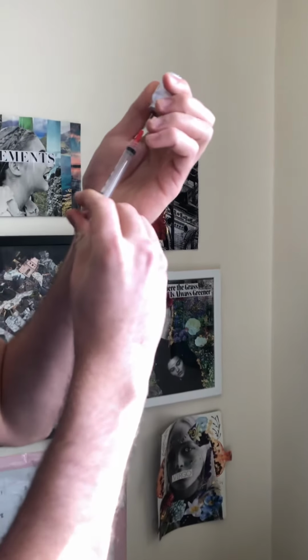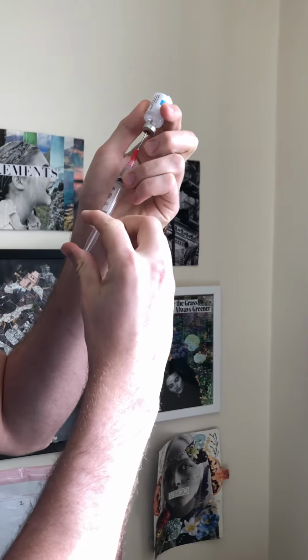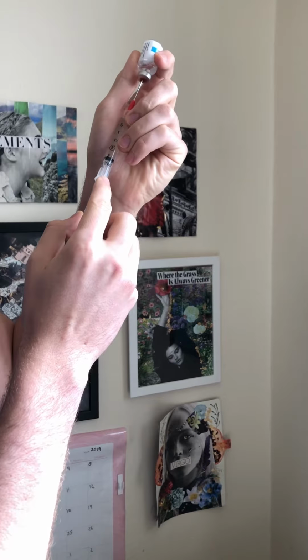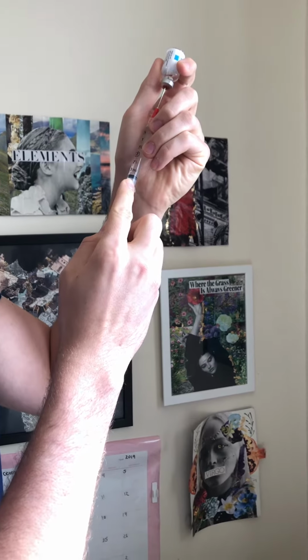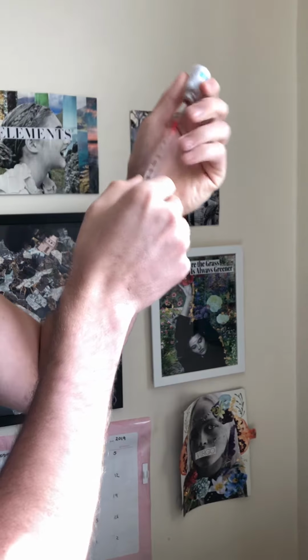Now we'll turn it upside down, and we'll pull the needle to make sure we're in the solution the whole time, and gently let gravity fill up the syringe. I need to grab 3 mLs, and we'll just go a little over, just to make sure. There we go.